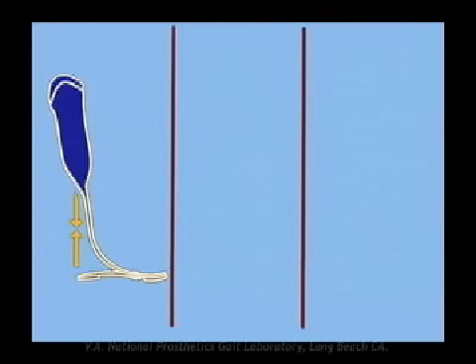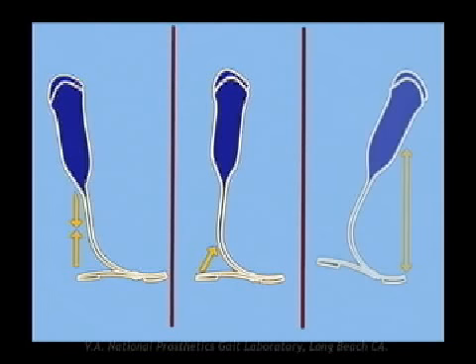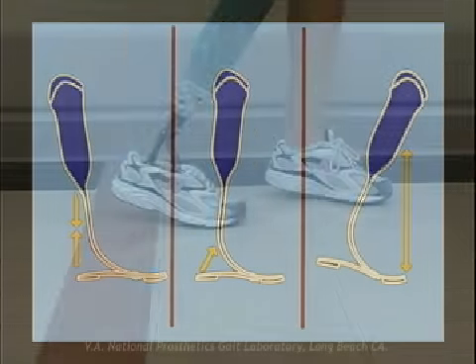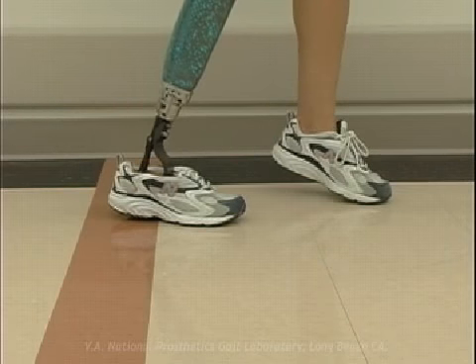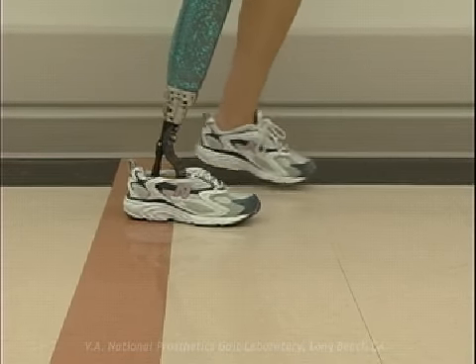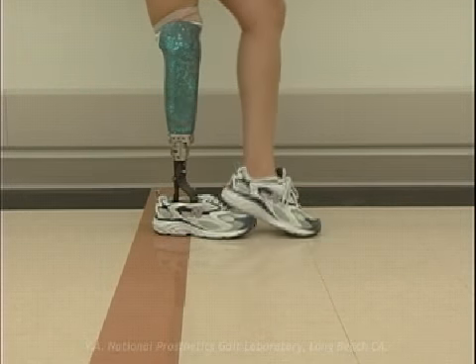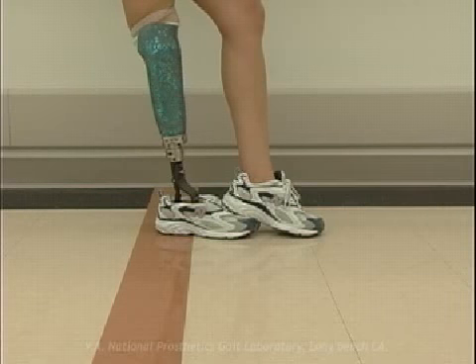It has been shown that the bladed-style prosthetic feet provide increased dorsiflexion compared to other designs. While the dorsiflexion is increased, there is a gradually increasing resistance to dorsiflexion at the terminal end of the range of motion due to the spring-back nature of this general foot design.